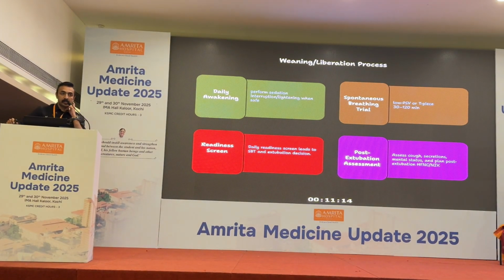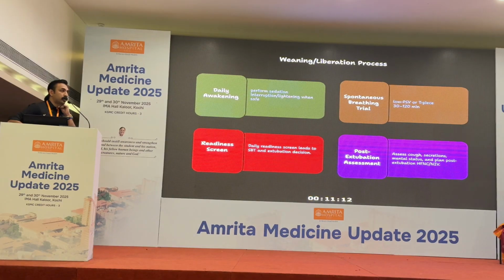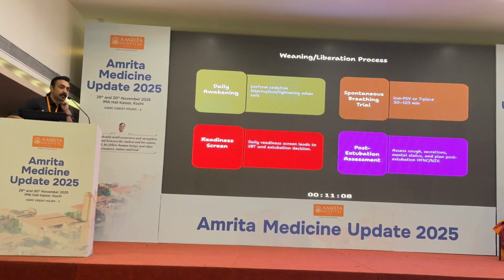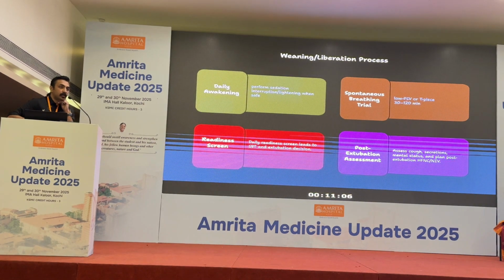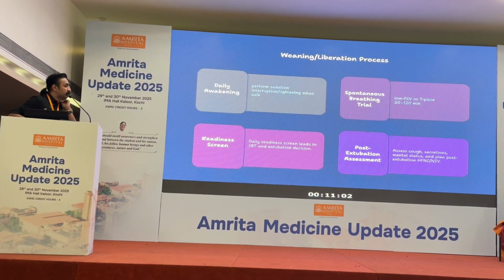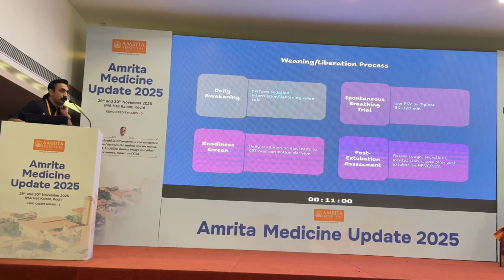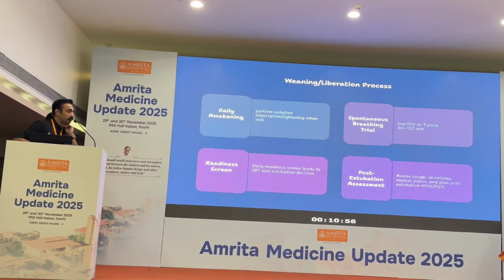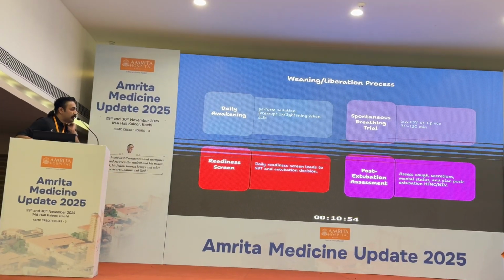Weaning and liberation, yes. Make sure that during your rounds, you at least ask yourself this question: is this patient ready for coming out of the ventilator, right? So always go for a daily awakening, that is by lightening or stopping your sedation. Go for a spontaneous breathing trial if possible, and do a readiness screen.